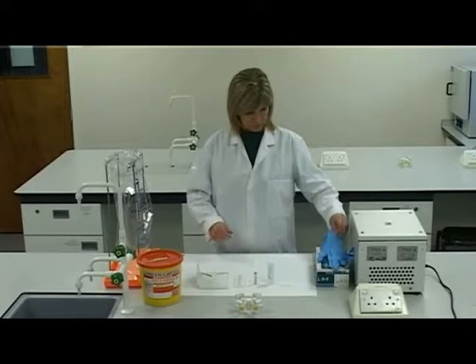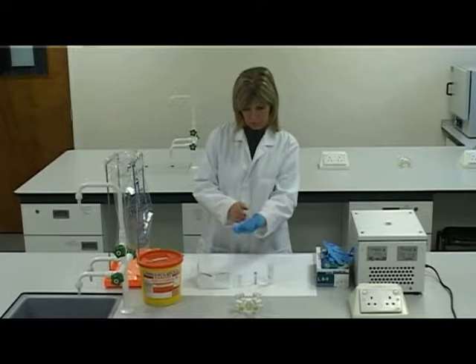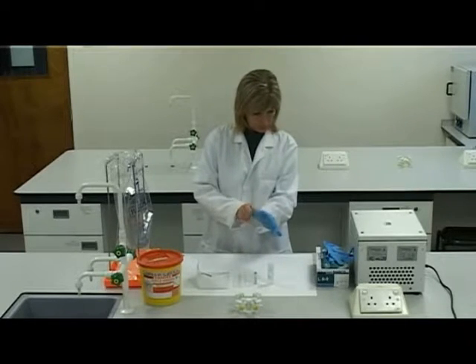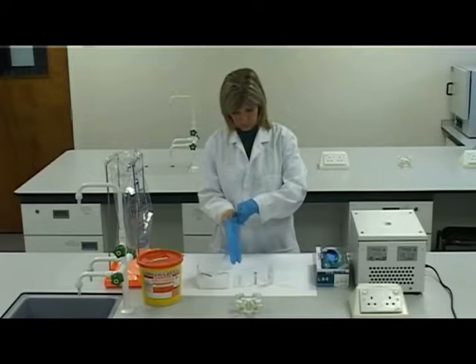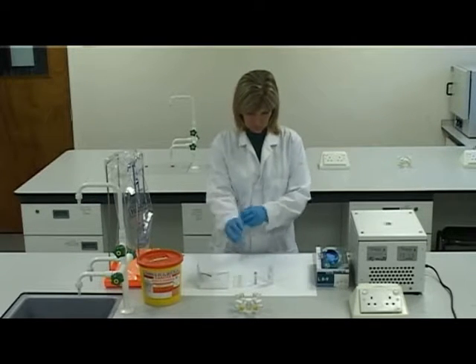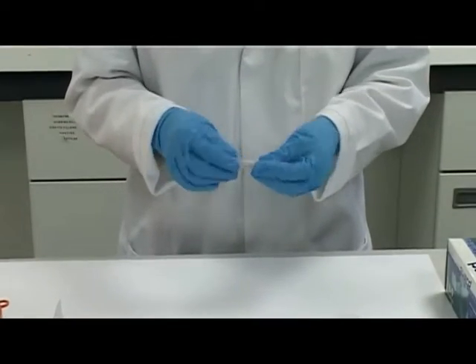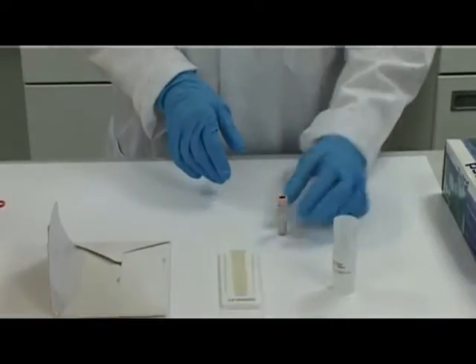Put on gloves. Select an EDTA blood sample and mix the sample gently. Remove a plain capillary tube.